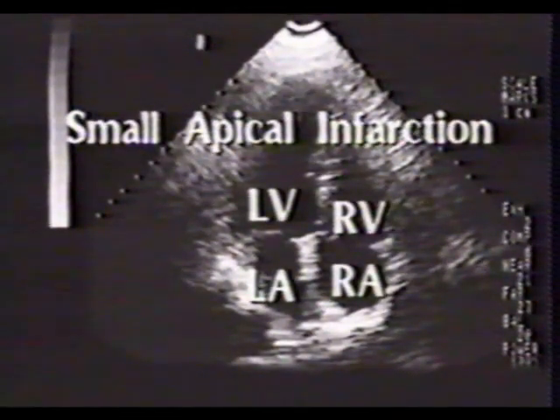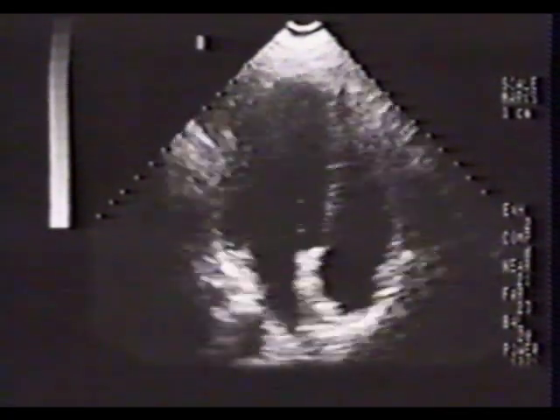Echocardiography was performed in the emergency room. There is akinesis of the apical septum with normal global function. This was the only abnormal segment identified. His wall motion score index was 1.1. With this small amount of myocardium involved, we decided against thrombolytic therapy. He stabilized with nitrates and a beta blocker, and his enzyme rise was small.